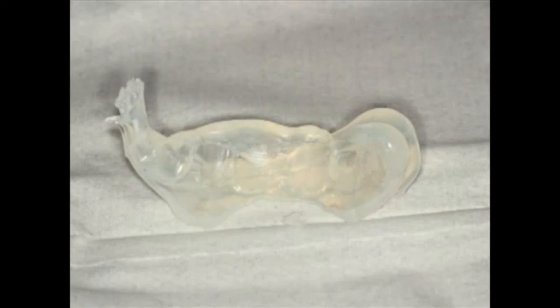Now remember, this patient had a diastema, and she wants to look perfect when she leaves today. If you look very closely, you'll see something sitting down here. I take my favorite composite shaping and placement instrument, my number 12 blade, and I cut the diastema out of this impression. Now this patient has an impression of her maxillary 8 anterior teeth, but without a diastema because it was cut out. It's now sitting down here.